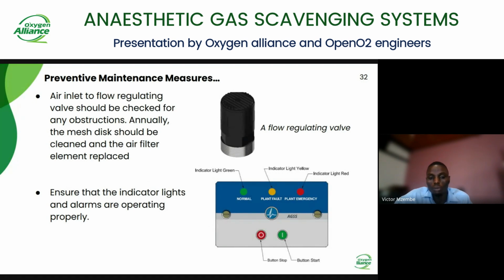Then it is also important to ensure that the indicator lights and alarms are working properly. This basically is more for the active system as well. So you just have to verify that all indicator lights and alarms are working correctly.